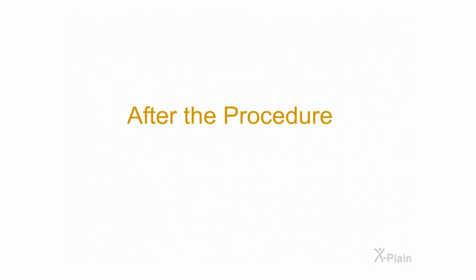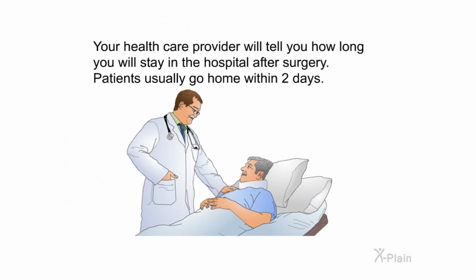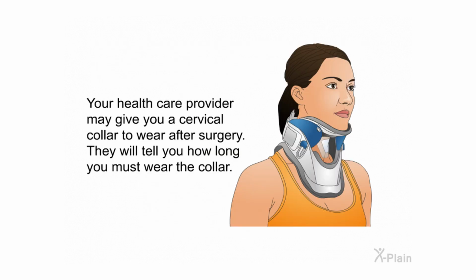After the procedure, your healthcare provider will tell you how long you will stay in the hospital after surgery. Patients usually go home within 2 days. Your healthcare provider may give you a cervical collar to wear after surgery. They will tell you how long you must wear the collar.